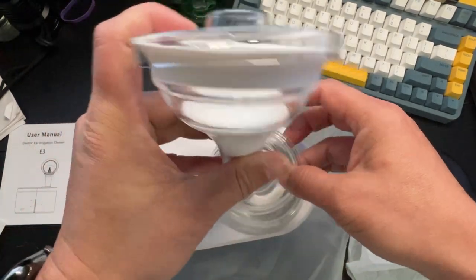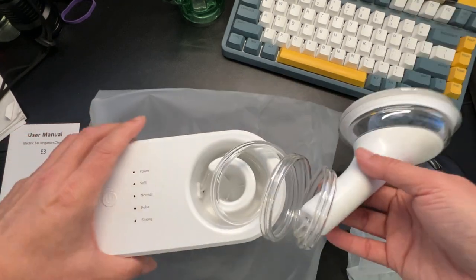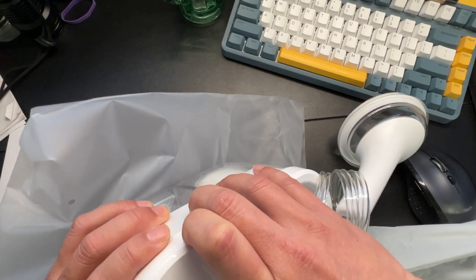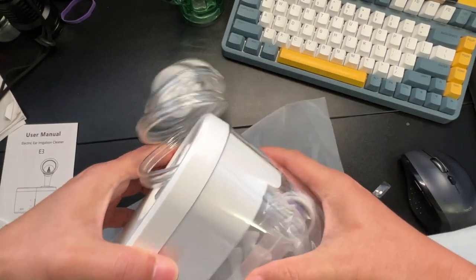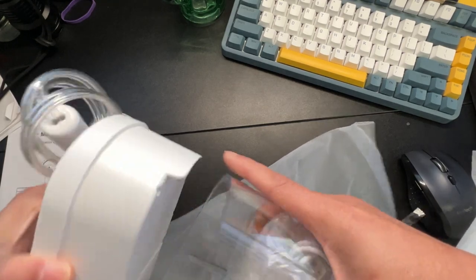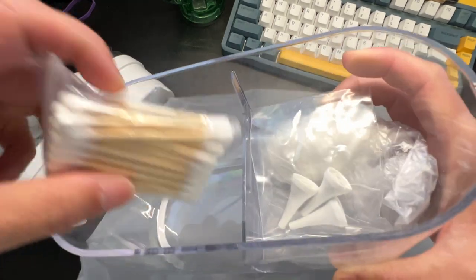This tube is a little weird but I think that's okay. It's a dual tube — one for the water supply and one for the gunk. I'm going to have to test this out to see how well it works, since squirting water into your ear isn't always the best thing.